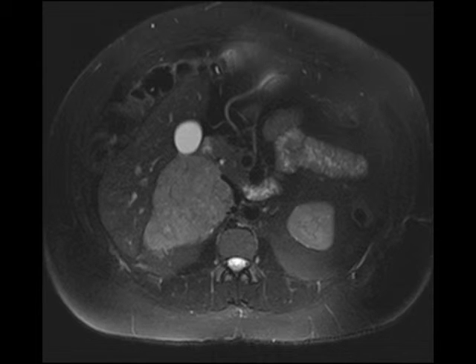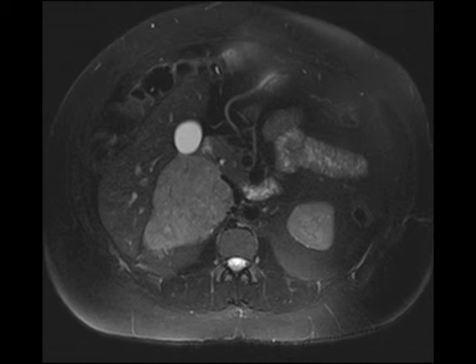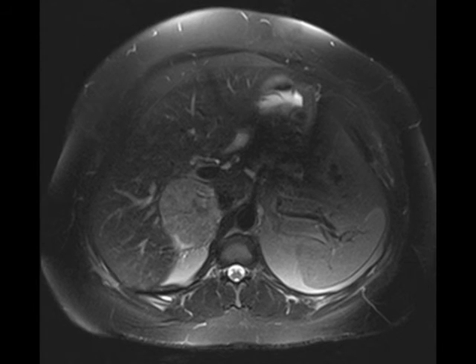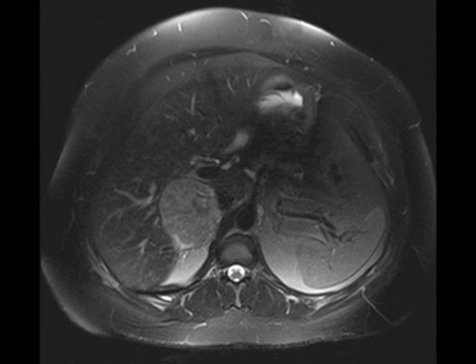In this case, certainly there is no evidence of internal macroscopic fat, so we're not talking about a myelolipoma. A lesion of this size with this degree of aggressive enhancement, you'd have to worry about an adrenal cortical carcinoma — which was in fact what this was. This was a large right adrenal cortical carcinoma at resection.